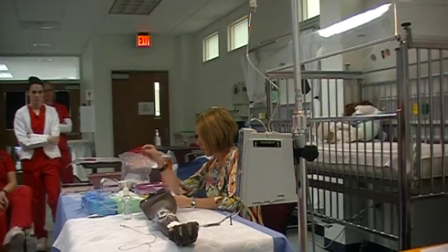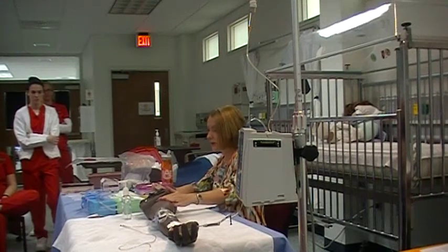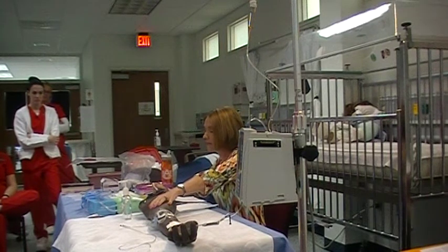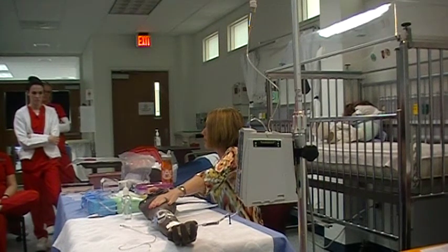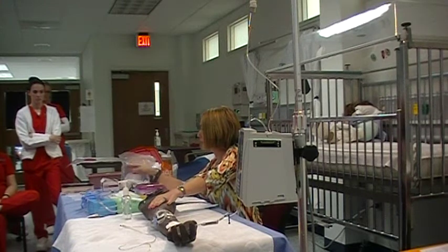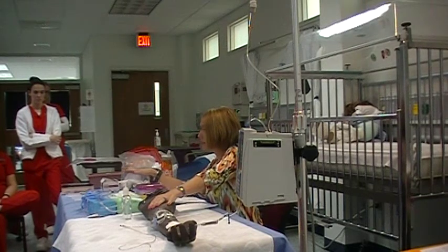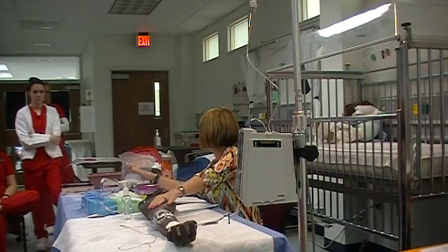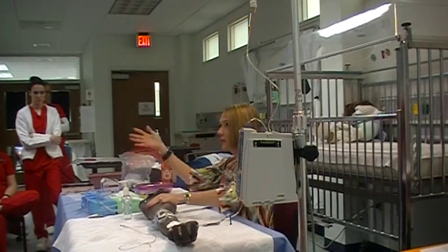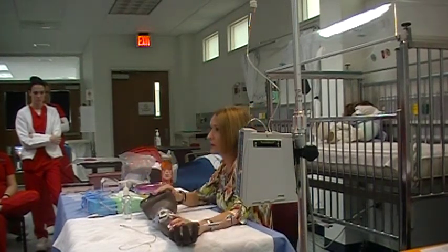When you get to the patient, it says in the next step to assess and verify patency. So this is when you would tell me I'm ready to go. You've got your alcohol, you've got your medication, you've got your 2 syringes, and everything is labeled. We're ready to go to the room, and you just confirm to me that you're ready to go to the room. So then we come to the patient's room, and this is where we're going to do our double identifiers.